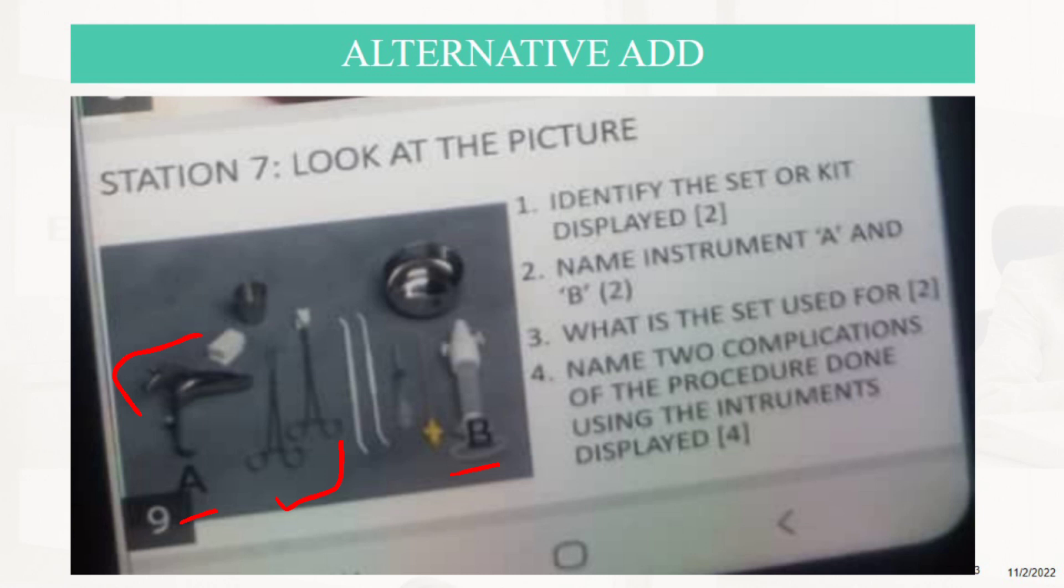This is the MVA pack with instruments A and B already mentioned. The set is used for evacuation of retained products of conception. Two complications of the procedure done using the instrument displayed - we've already mentioned those complications. This was about the MVA pack and we're done with this one.